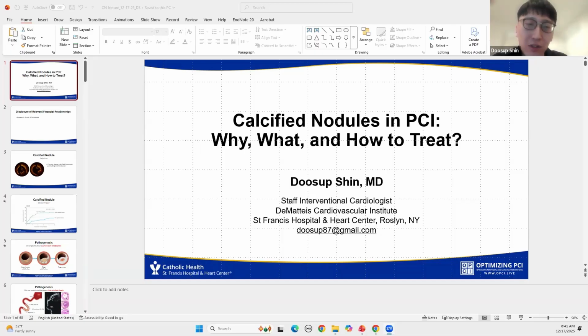So, there are multiple things that you can consider, but beyond 120, I'm not sure whether you're going to get additional benefit from doing more pulses compared to the money that you invest in the case. Maybe you're not going to achieve a major difference after more shots. I'm not sure whether you have any experience with that, Dr. Cortes, whether you used many more pulses and achieved a better outcome.